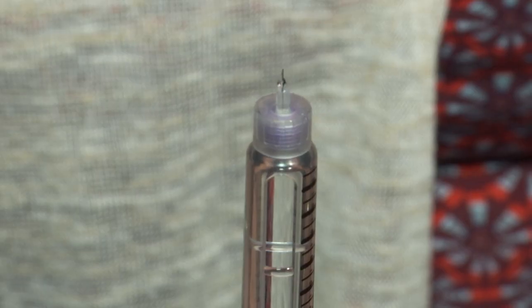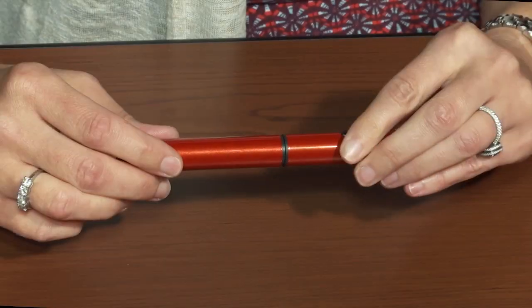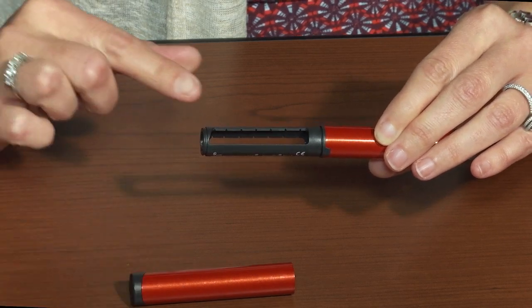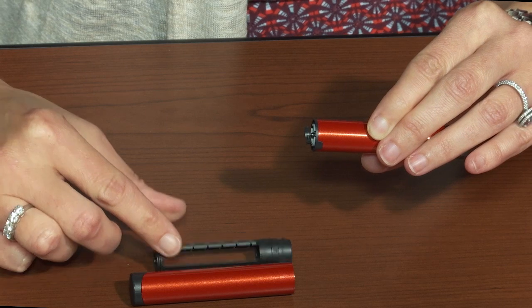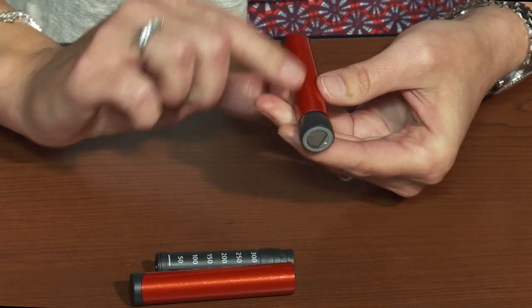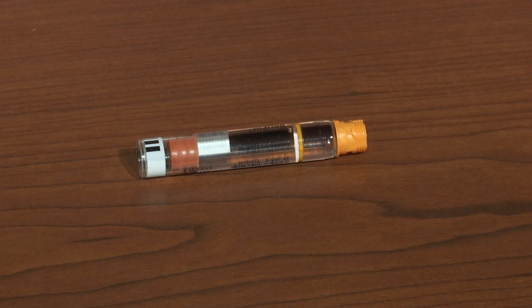The reusable insulin pen consists of the pen cap, the cartridge frame, metal lead screw, and the injection push button. Before using the refillable pen to inject insulin, you must first install an insulin cartridge.